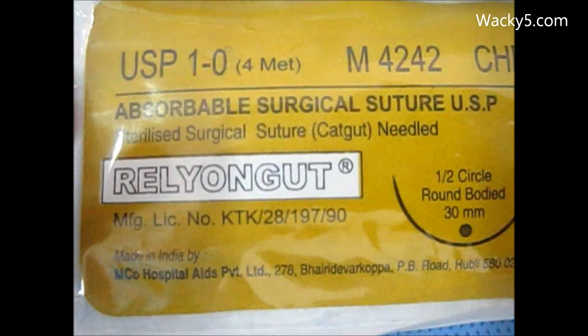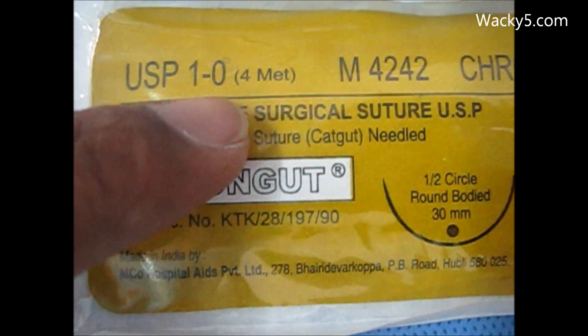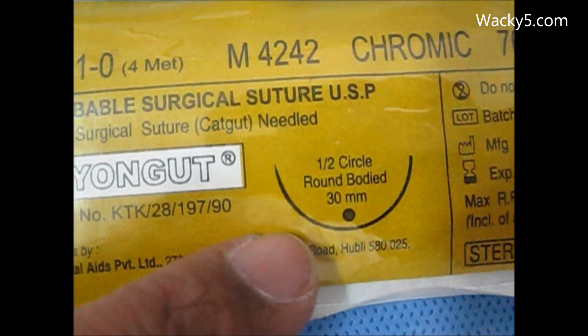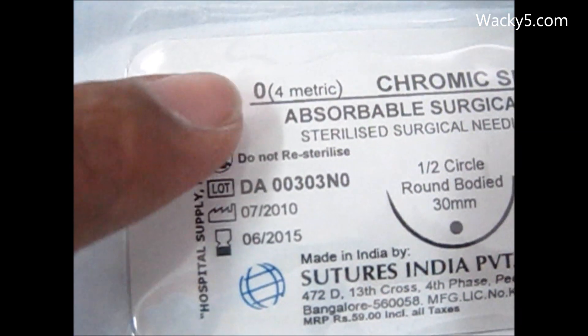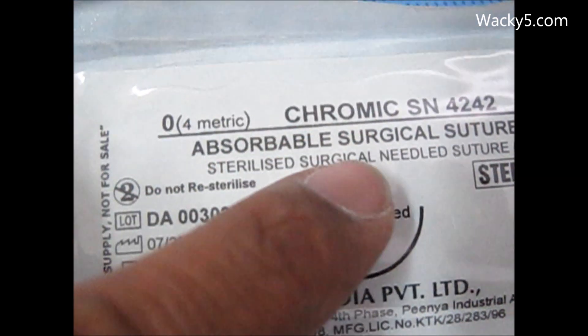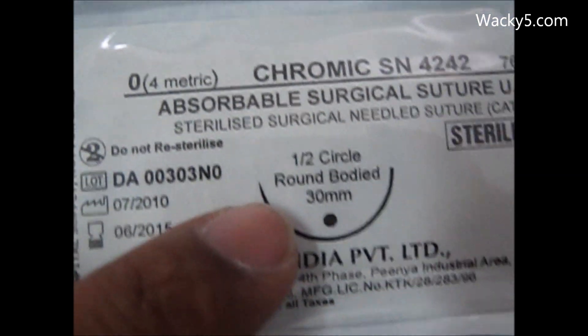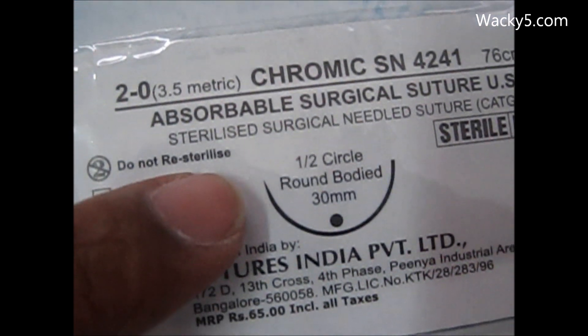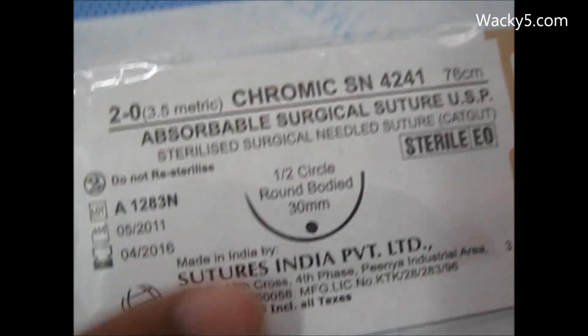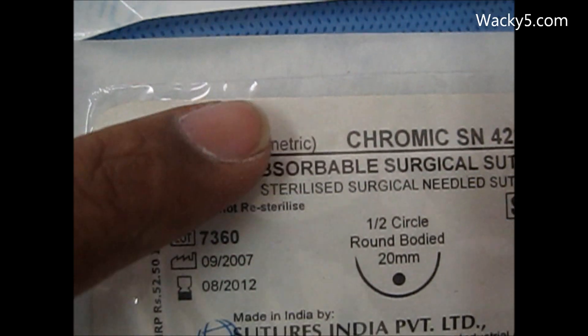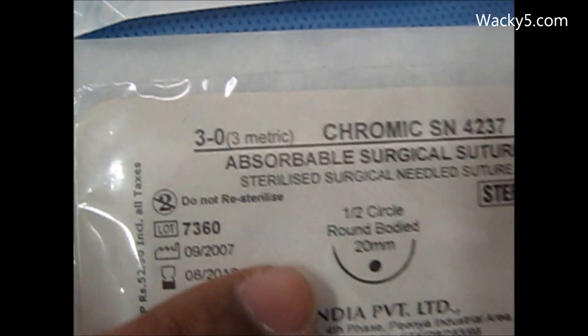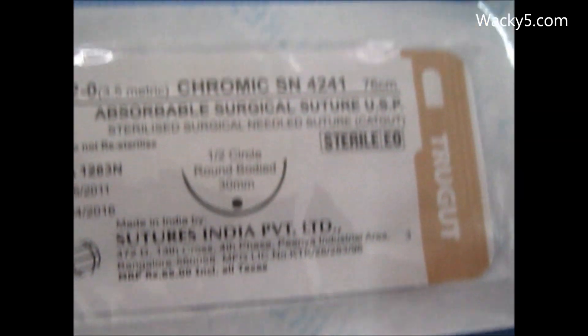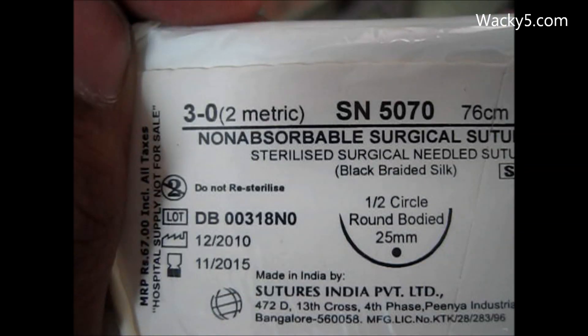Now have a look at this absorbable surgical suture. You can see a 30 millimeter, half-rounded bodied needle. This circle shows the needle. You see 2-0 here, and it will be 3-0 — so 3-0 will be more finer.